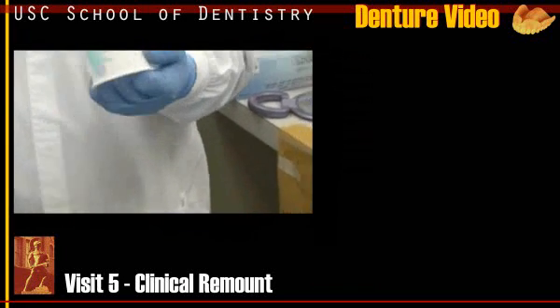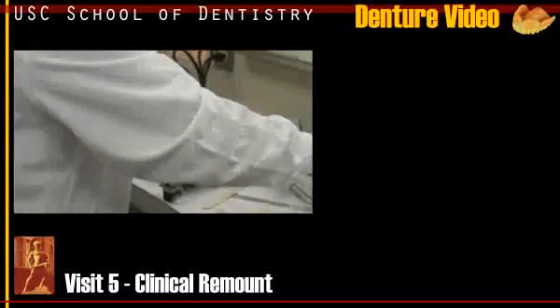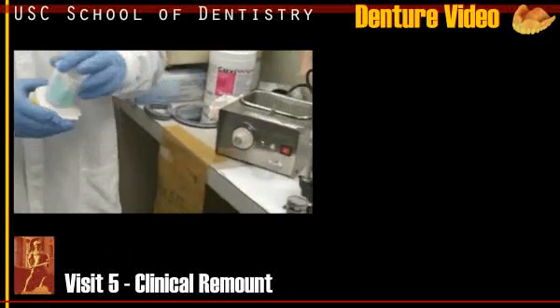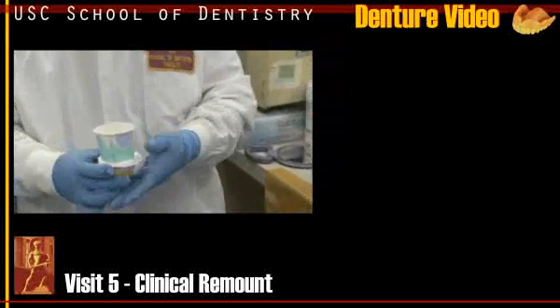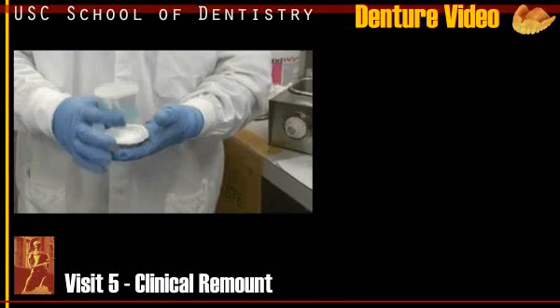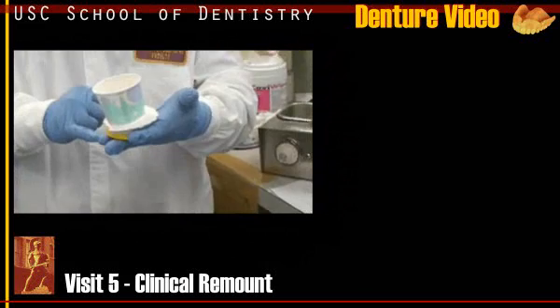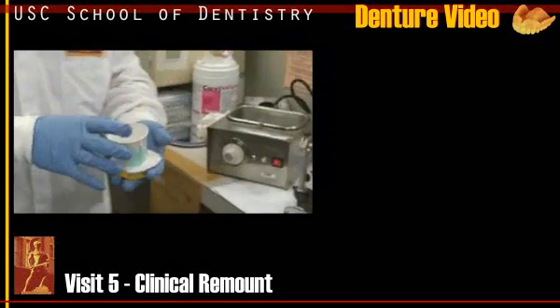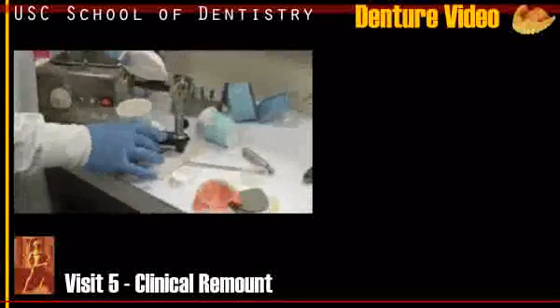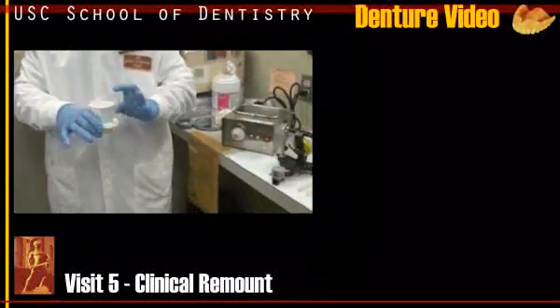Okay, so you cut it like this, right? And then let's say that there's no plaster in here, okay? So you can apply on here, right? Then you can drop down some plaster. So this cup is held by the plaster with this rim, right? And then after that, you're trying to put it in. This is too tall, right?